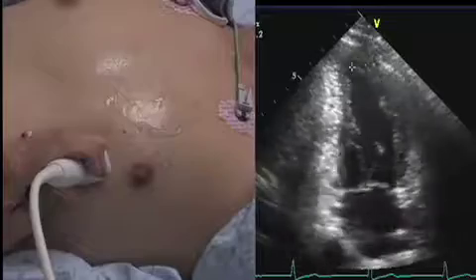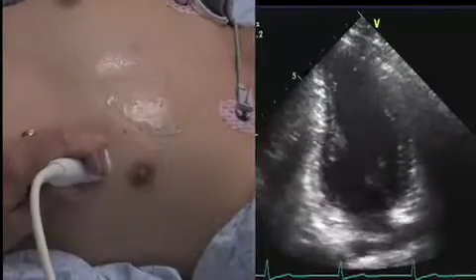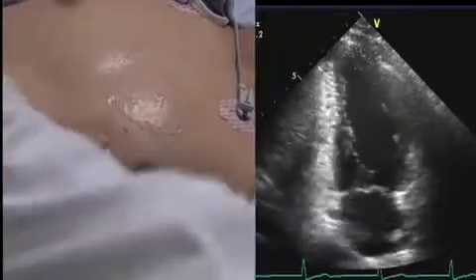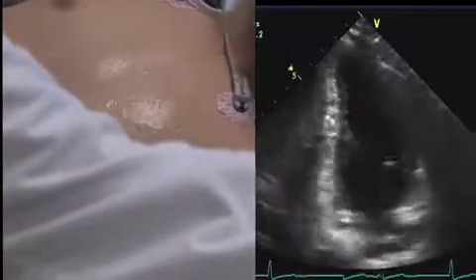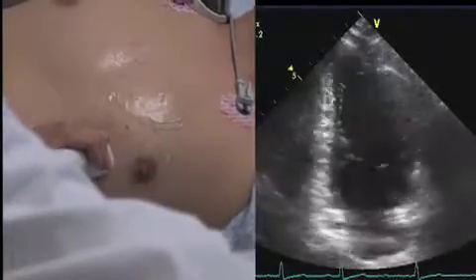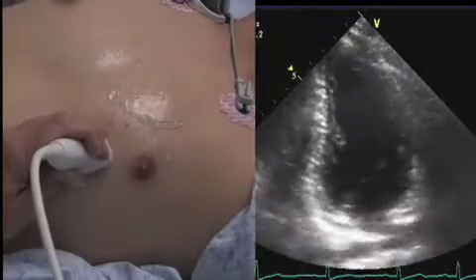And in this case, we've got a really nice apex. One of the things you can also adjust, as you can see here, is our focus. So if I move my focus — if I'm not seeing the apex well — I can move my focus towards the apex and then often increase the gain a little bit, and now it may be a little bit easier to see exactly where that apex is.